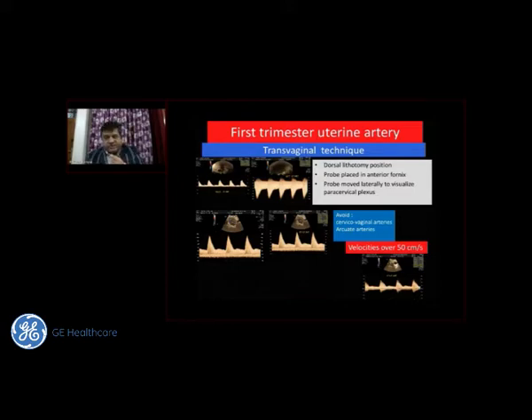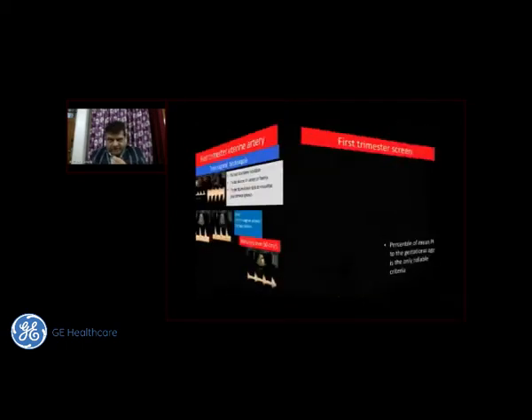And how do we know this? We must remember that the velocity of the uterine artery should be over 50 centimeters per second. And if that is not happening, please remember to repeat again, look for a proper uterine artery, take your time, and then go ahead and interrogate the uterine arteries. Because sometimes the branches can be interrogated with a lower velocity and give you a false reading.